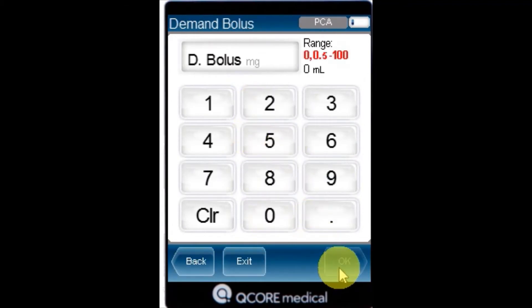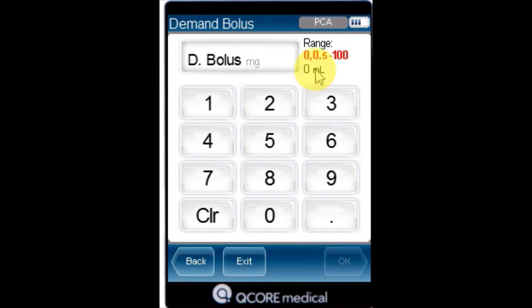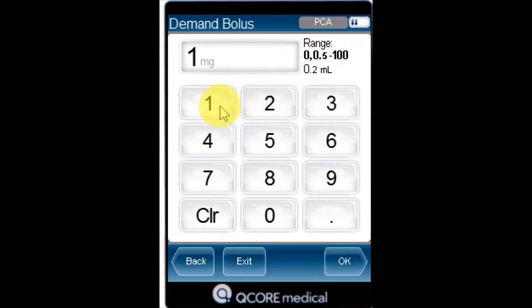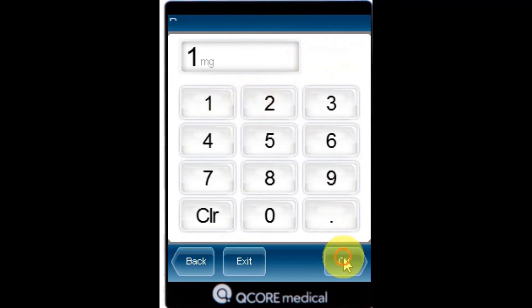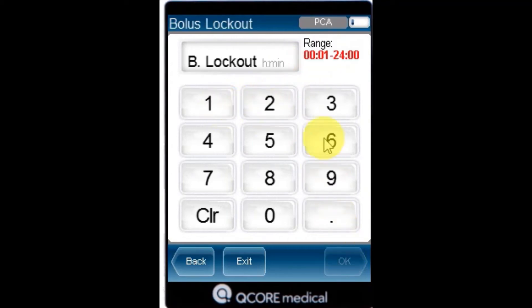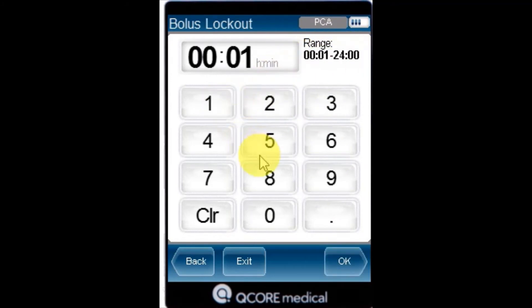The continuous rate can be set to zero. Using the keypad, enter the value for the demand bolus, and then press OK. Using the keypad, enter the value for the bolus lockout, and then press OK.